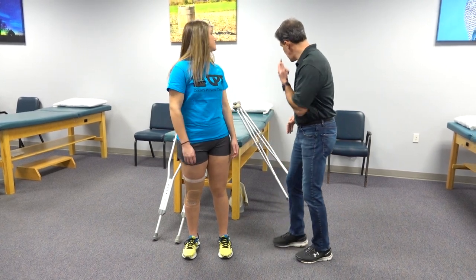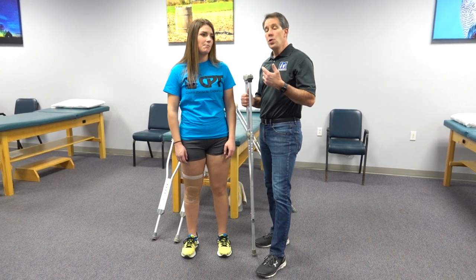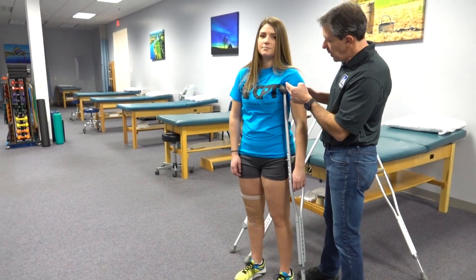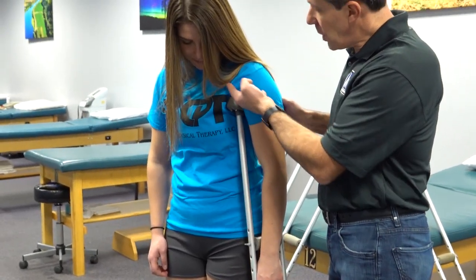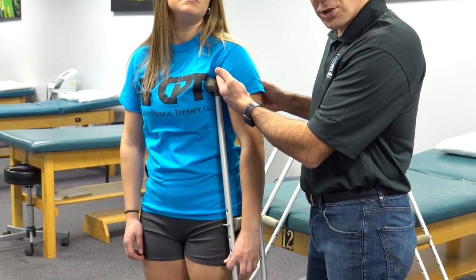The first thing I want to do is talk about what a crutch that is too tall looks like. Here's a very good example of a crutch that is too high, putting a lot of pressure in the armpit. There are a lot of blood vessels and nerves that cross through the armpit that can cause issues down the arm if you're putting too much pressure there.